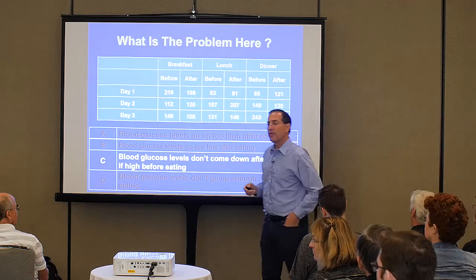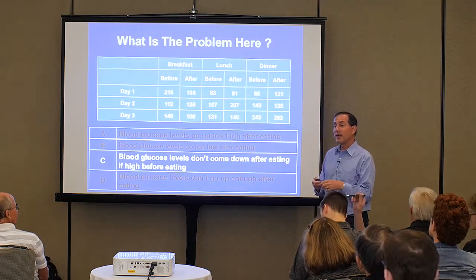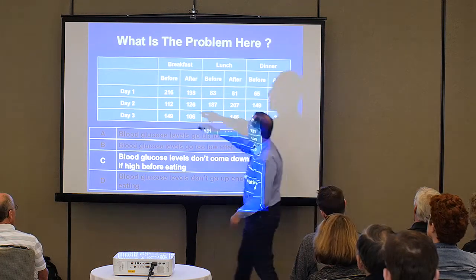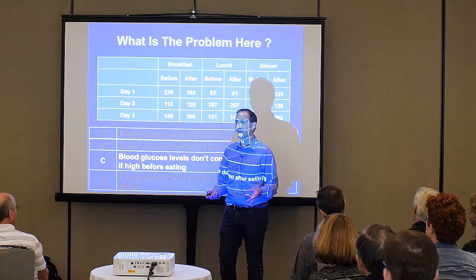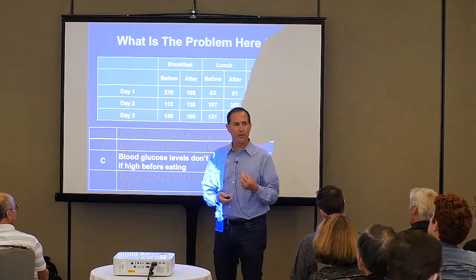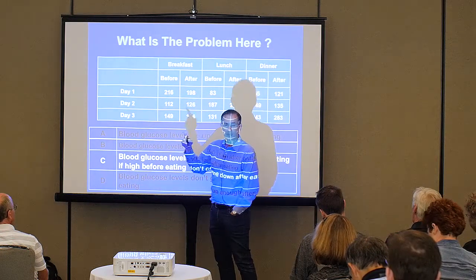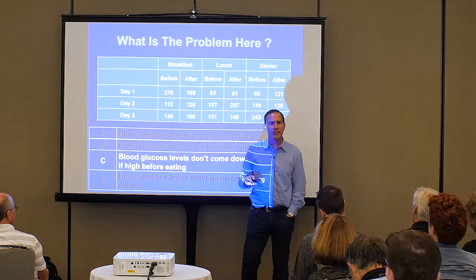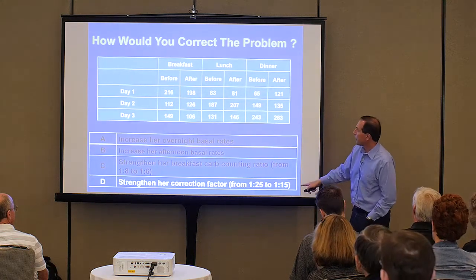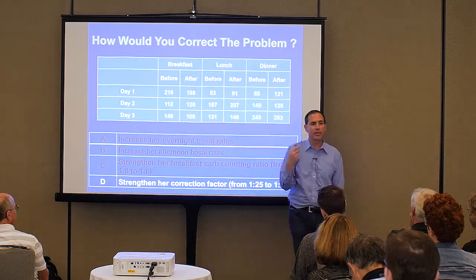So, what is a correct correction factor? Well, it depends on the individual. Each person's different. So I'd recommend, if you don't normally adjust your correction factor, and you find that you start off high before a meal, you end up high after, and you feel frustrated, and that happens to most people, I find, speak to your healthcare provider, especially your pump trainer or nurse educator. They'll mentor you, because people need to be taught how to safely adjust the correction factor to bring that down. In this case, it was a matter of strengthening her correction factor so that she got more insulin when she started off high than if she'd started off there for the same amount of carbs with the breakfast.